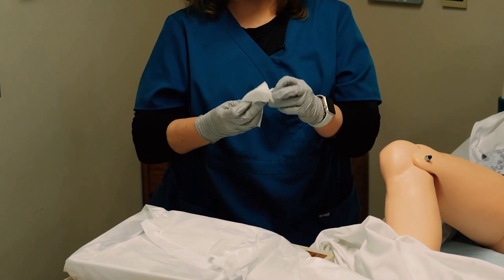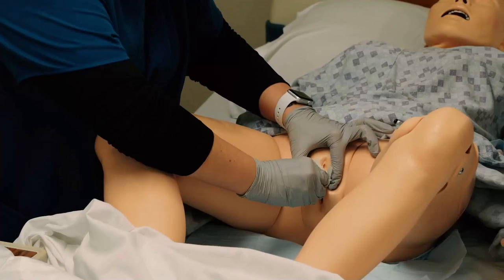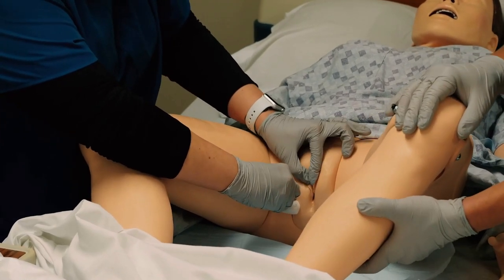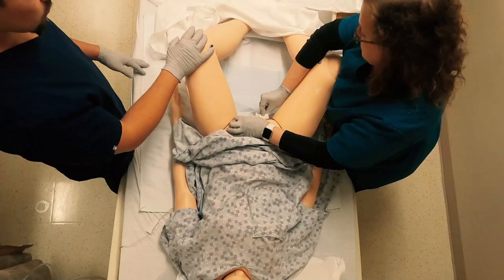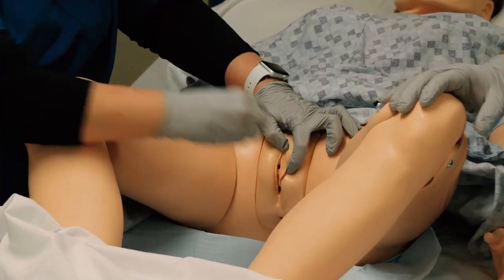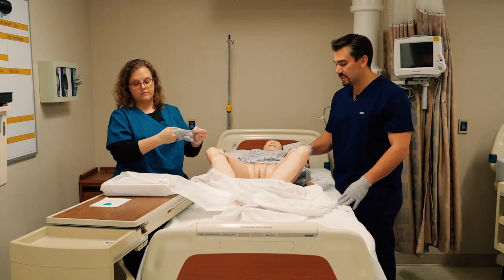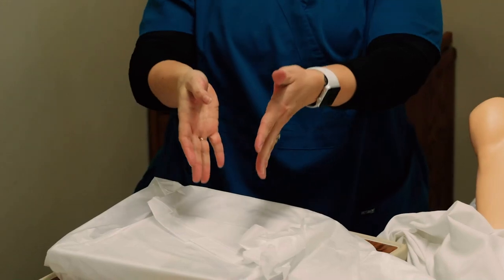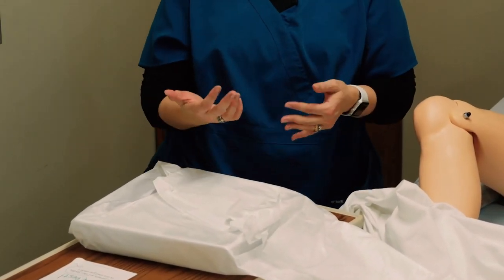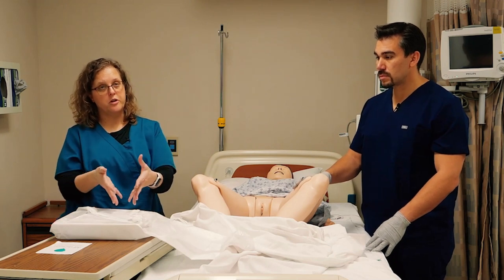If the patient had feces, you would have wiped that away before you even get to this part. Because this is clean, I can continue to fold it as needed to make sure everything is clean. The meatal opening is the part I really need to get the cleanest. You can clean the outside, but the important part is really the inside. You never want to introduce bacteria into the urethra — that's huge. Now I'm going to take off my gloves. A lot of kits will have something here for hand hygiene, since you've done a dirty procedure first. Ideally you'll have some hand sanitizer here, whether it's alcohol or stepping away to wash your hands.